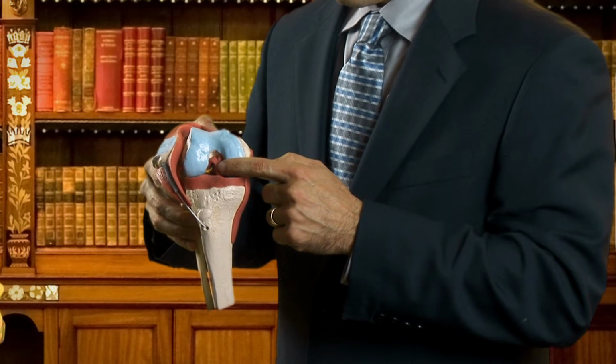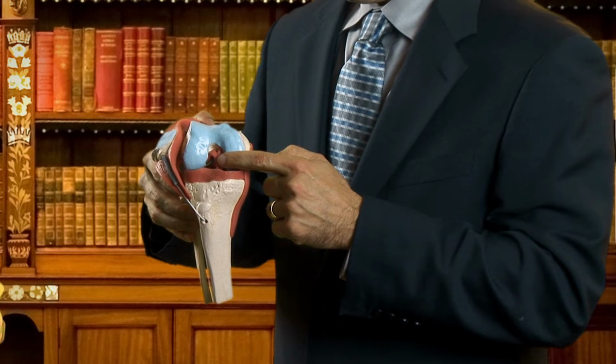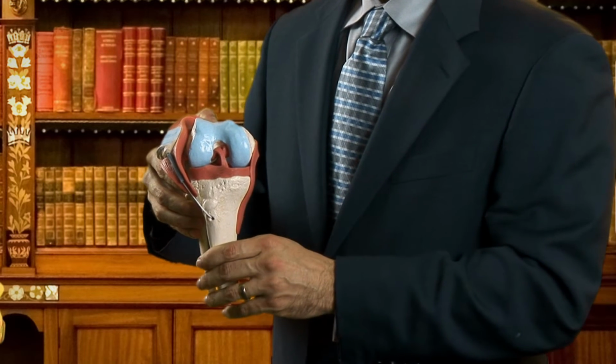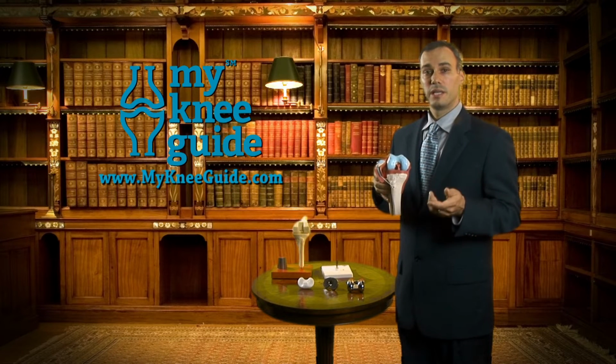The surgeon will identify the anterior cruciate ligament, and this will be resected and removed. This gives access now to the posterior cruciate ligament, or PCL. Now, the PCL may or may not be removed in your particular surgery. The decision for removal of this ligament depends on surgeon preference and your particular anatomy. You can learn more about the indications for retaining or removing this ligament in the prosthesis section in the Learning Center.